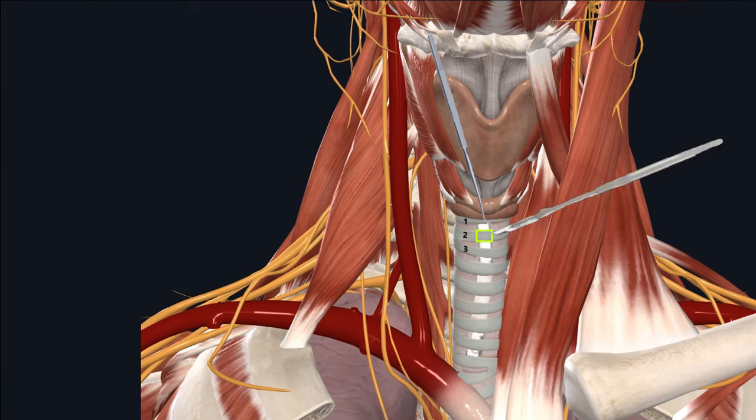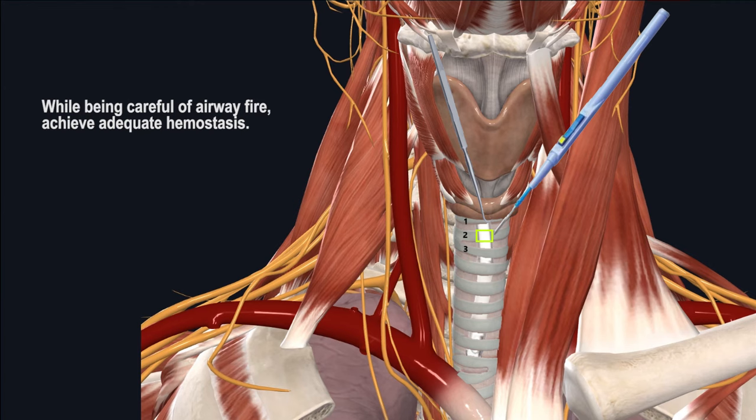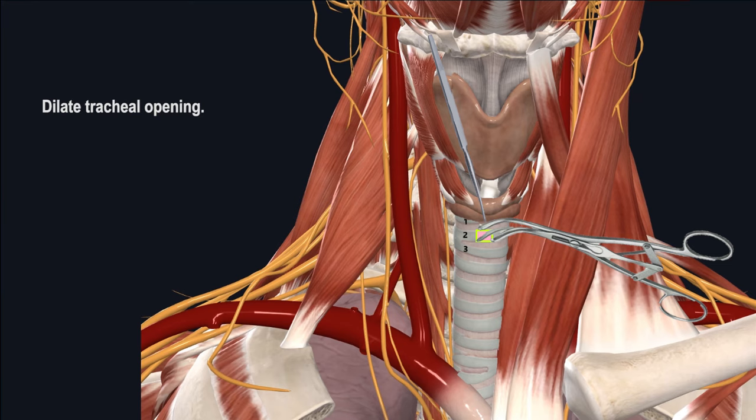Go ahead and make a tracheal opening by making either a small window or a Bjork flap. It's common to see cartilage edges bleeding, and you can use light electrocautery to control any bleeding while being aware of the risk of airway fire hazard, especially if your FiO2 is higher than room air. Next, you will want to pull the endotracheal tube back while visualizing through the tracheal opening. The tip of the endotracheal tube should stop immediately past the superior margin of the tracheal opening. Go ahead and suction any mucus or blood from the trachea. Then, using a tracheal dilator, dilate the tracheal opening and remove it out of the way.